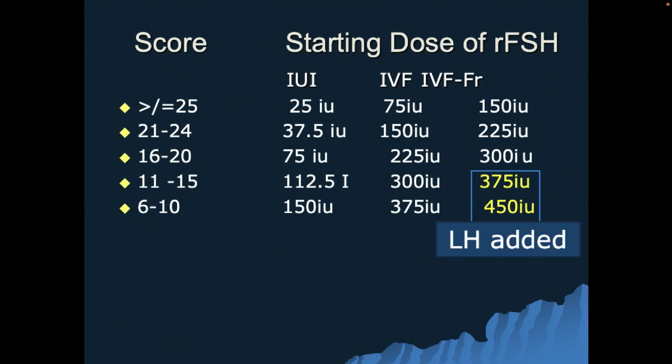So how do you follow up the cycles? You know what is the baseline score, we know what is the dose depending on what is the treatment, and then we start stimulating the patient. Say, for example, we first talk about the IUI cycle. Whatever protocol it is, I repeat, if it is an oral ovulogen cycle, you don't have to do a baseline scan. But if it is a gonadotropin to be used, that is when you need to do a baseline scan. And a baseline scan done once works for at least 6 months. That means only when you convert a cycle from IUI to IVF, you will have to repeat it. Otherwise, it is to be done only once during the treatment. You don't have to call the patient every time on day 2.